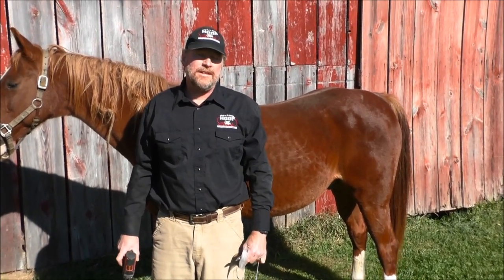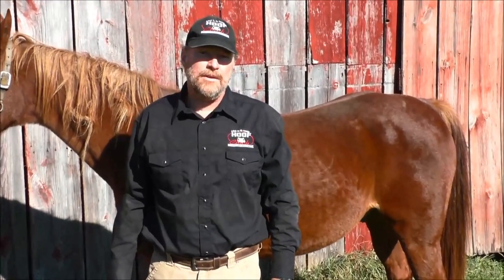Hi, I'm Chuck Potter, inventor of the hoof cinch, and today we're going to show you how to install the hoof cinch properly.